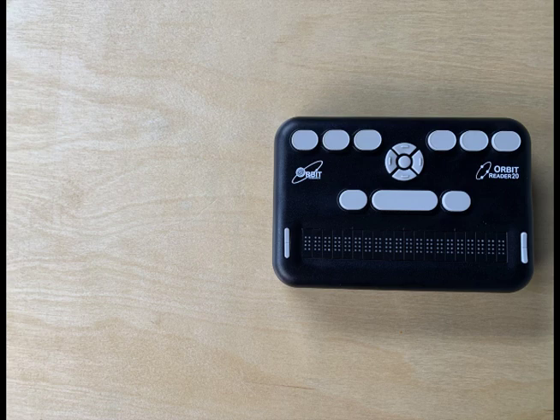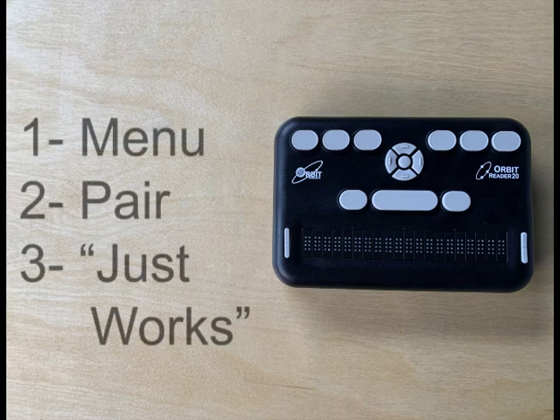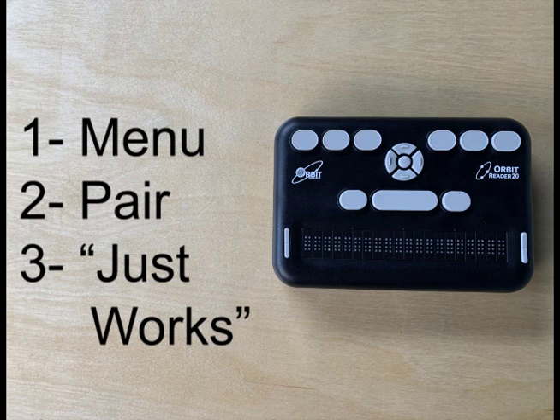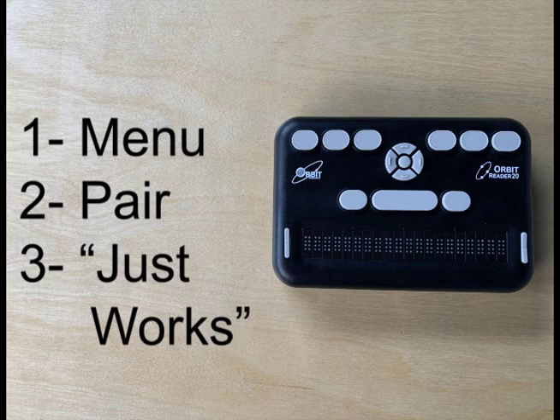By default, the Orbit Reader 20's pair settings is set to JustWorks, so the device is ready to pair with the iOS device. To check that the device is set to JustWorks, go to the menu, then navigate to pair, and then ensure that JustWorks is selected.